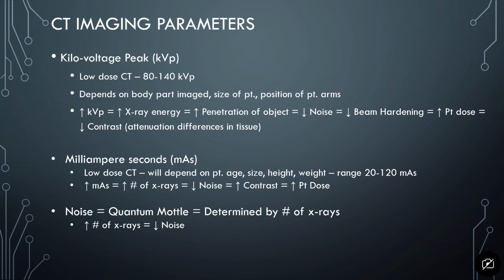That's very similar to nuclear medicine. The more counts that you have in the image, the lower the percentage of noise there is. So that's kind of the same concept, except it's CT. We can't just take the image for longer because we're acquiring what's coming off the patient. We have to actually produce more X-rays in the X-ray tube. So other than that, the concept is very similar.